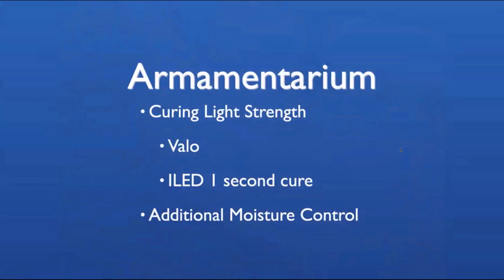One thing that I would highly recommend is getting a very strong curing light. As a matter of fact, I have a Valo and I've had it forever. I've come to realize that the Woodpecker more premium curing lights work just as effectively. May not have the same lifetime with a Woodpecker, but definitely does the trick.